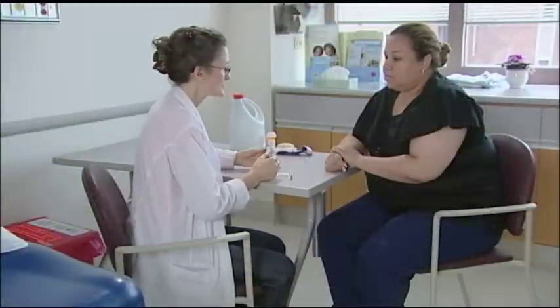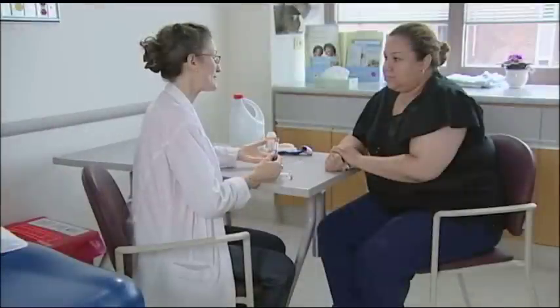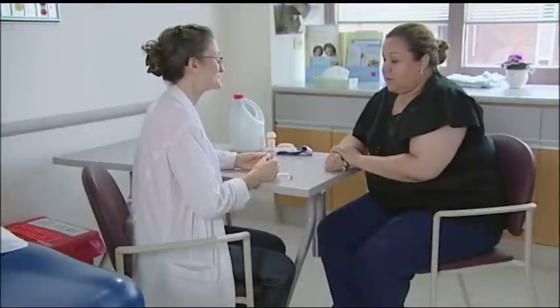Miranda, your doctor has prescribed the insulin pen — it's a really convenient way for you to take your medicine to control your diabetes. It looks like a ballpoint pen, except you can't write with it. You use your insulin needle only once, but you can get multiple doses of insulin from one pen.